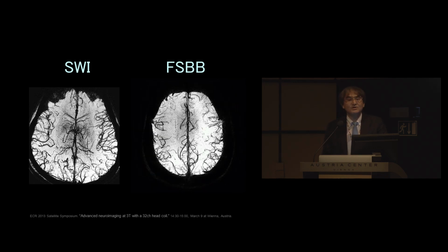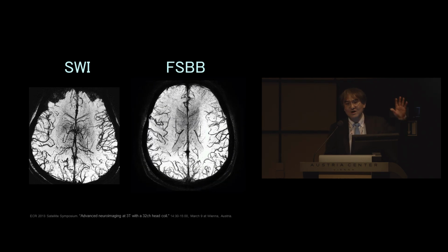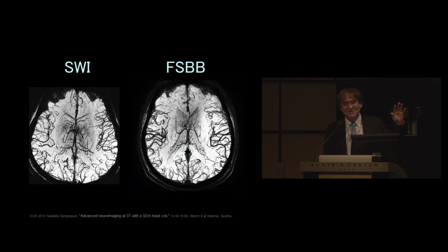So I'd like to ask you, how many people know about FSBB? Those who know FSBB, please raise your hand. Very limited? Have you never heard that?